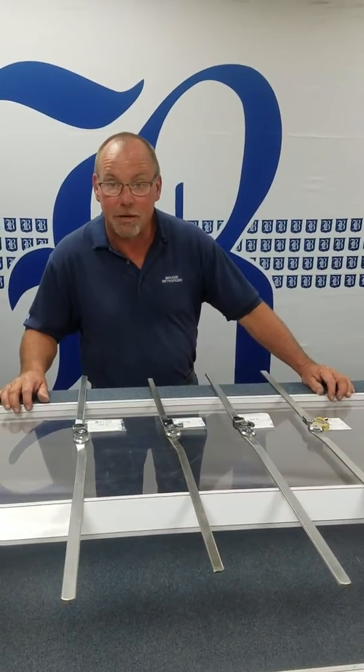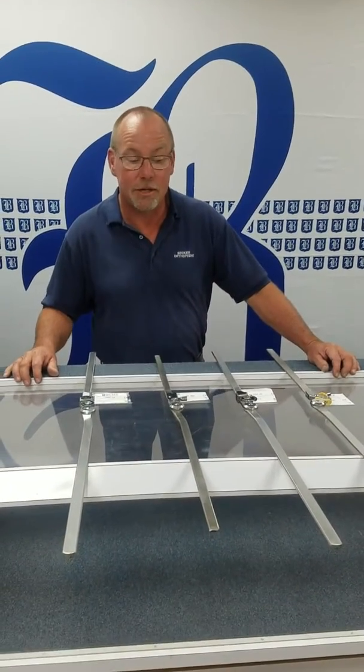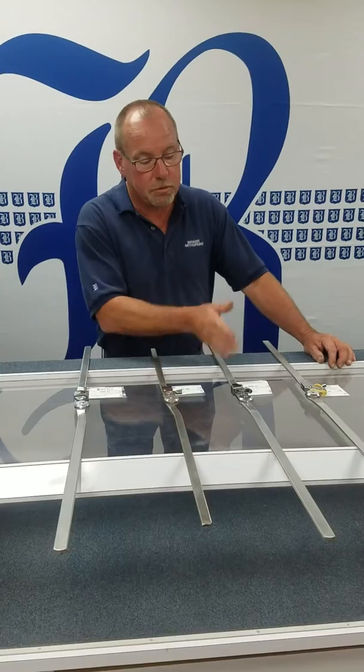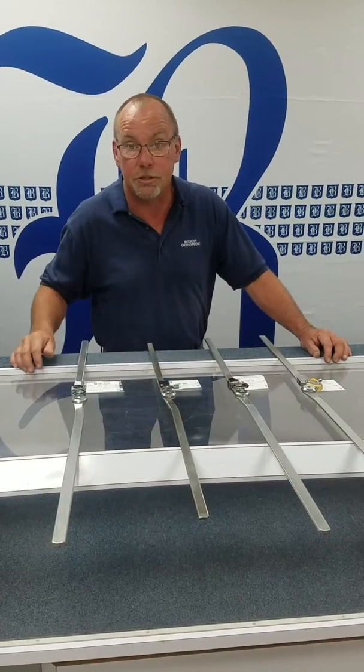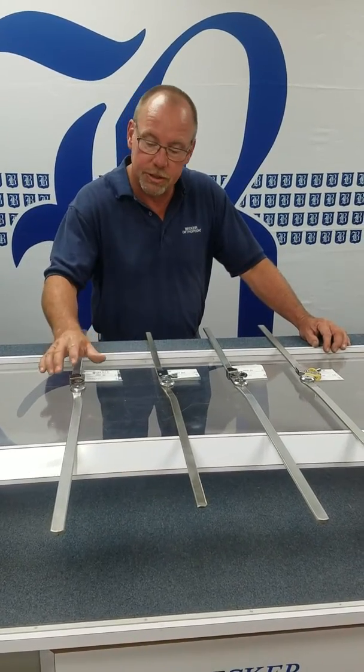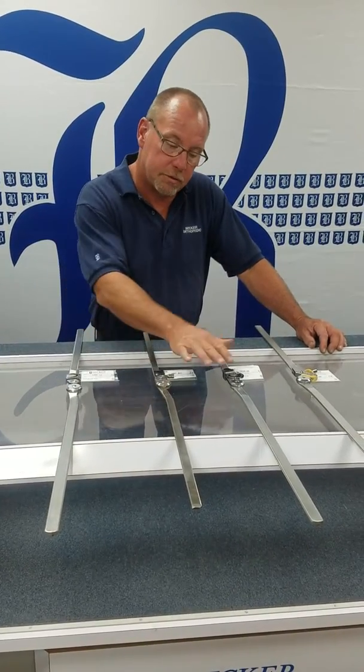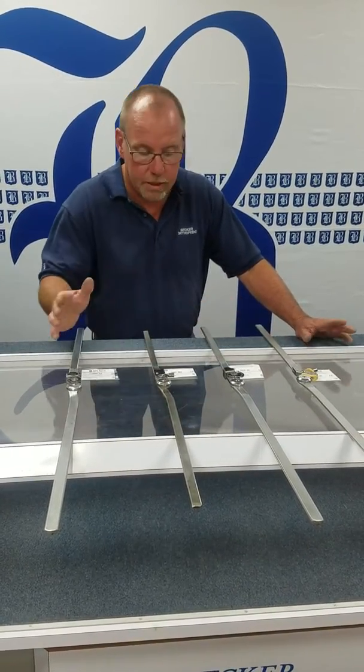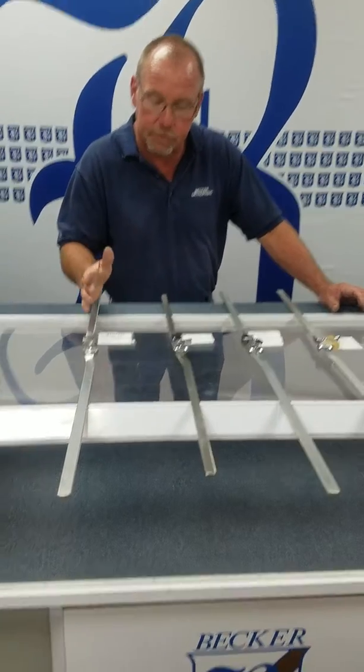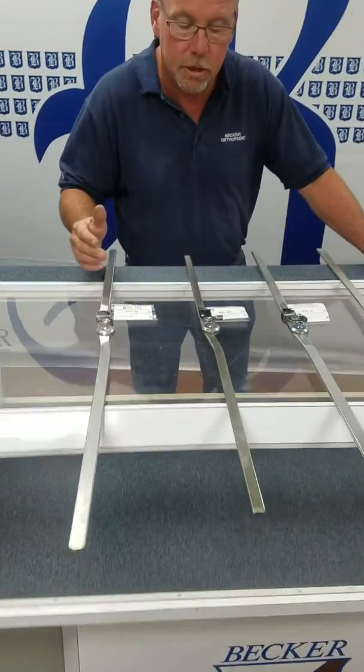Hi, I'm Roger from Becker Orthopedic. I wanted to show you our line of adjustable flexion knee joints. Each of these joints has serration that you're capable of changing in six-degree increments.